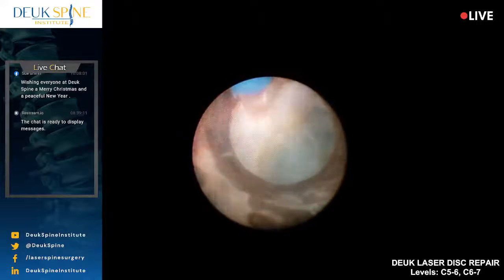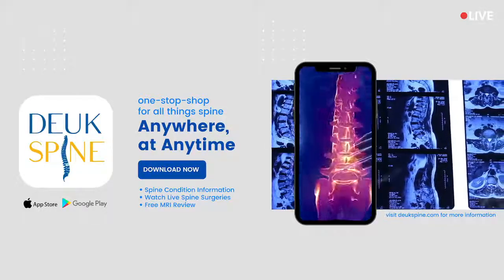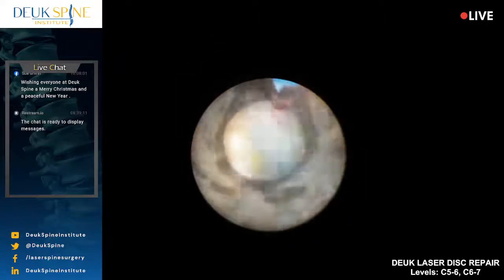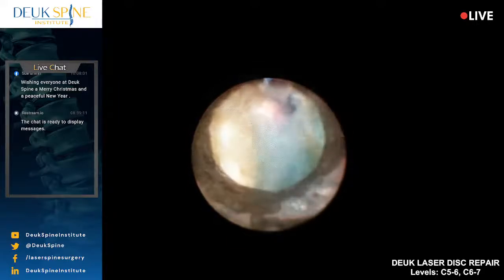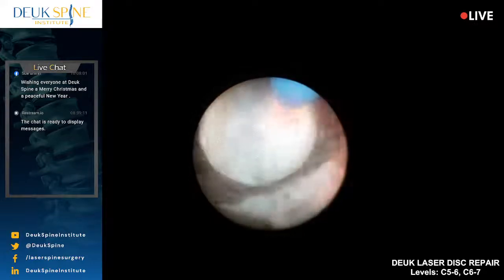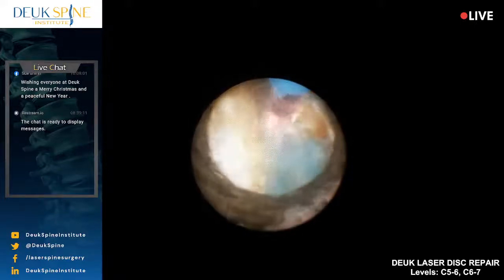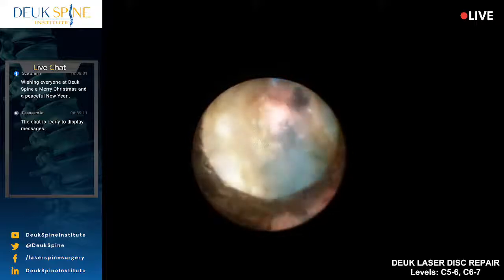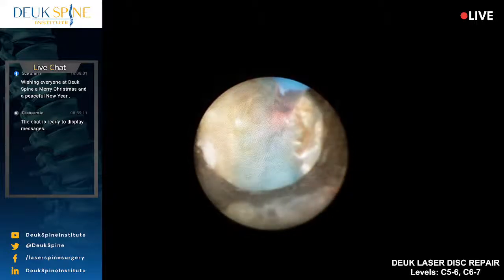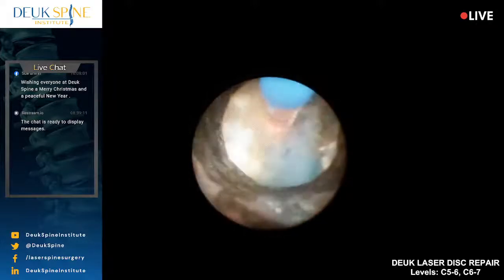This laser is a holmium YAG laser. There's different types of lasers used in surgery and medicine, and this is literally the best for this application. The holmium YAG laser is extremely safe for the staff and the patient. It's also, I think, more expensive than other types of lasers, but it's worth it. It produces an incredible beam of energy, and this particular unit has a beam that creates cavitation in the liquid. Cavitation, this is all inflammatory garbage right here, junk, collagenized disc material that we need to get out.